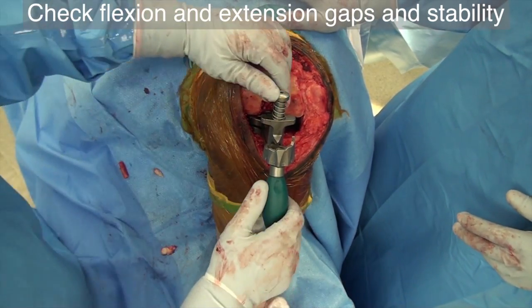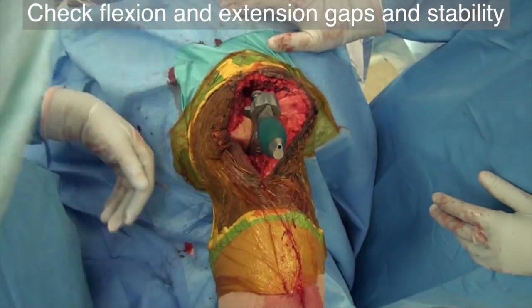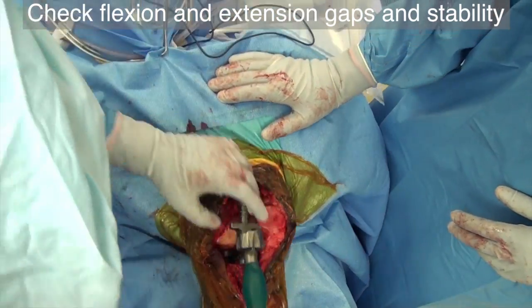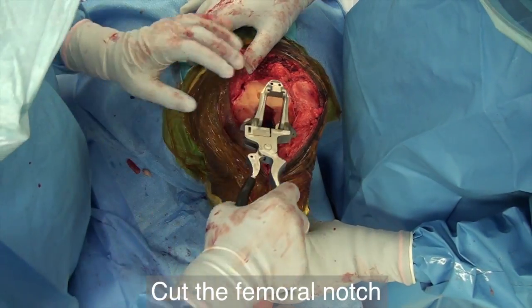Measure and compare the flexion and extension gaps. Check stability in extension, full flexion, and mid-flexion. Also recheck if the extremity reaches full extension. Cut out the femoral notch.